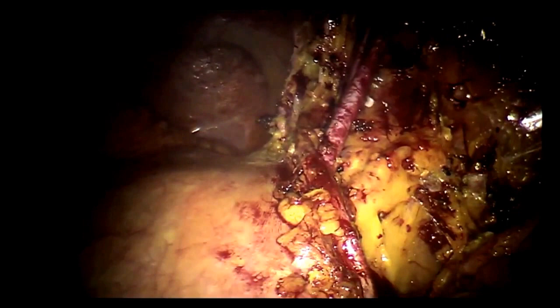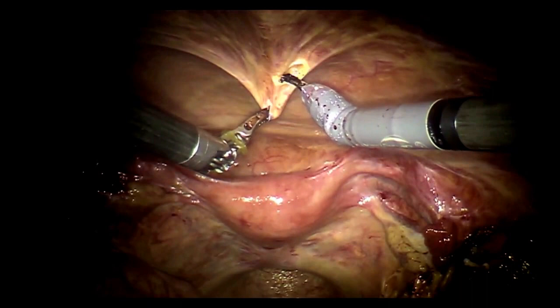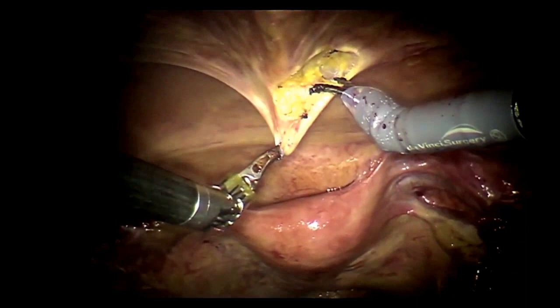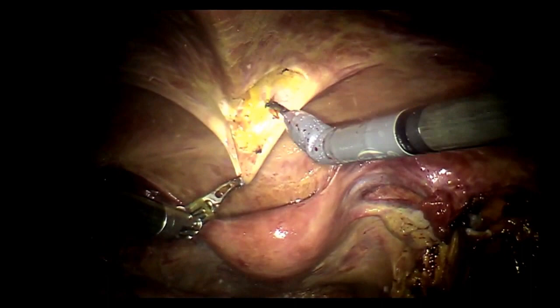You're going to just combine the two ends of that flap, right? Over the kidney, correct. That's the hope. And if the kidney becomes too big in size, then the flaps don't have to touch each other. We can just retain the kidney with stitches, just using this as an anchor. It's not a big deal.